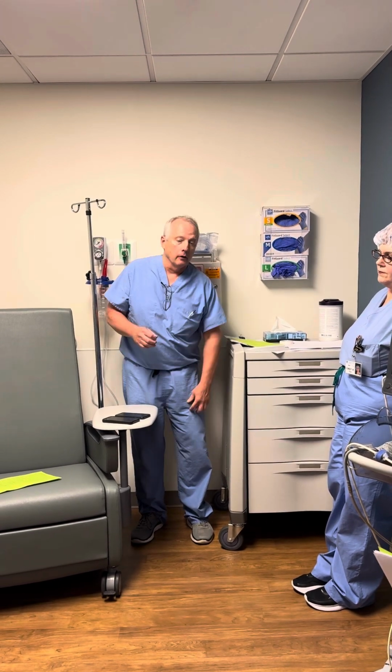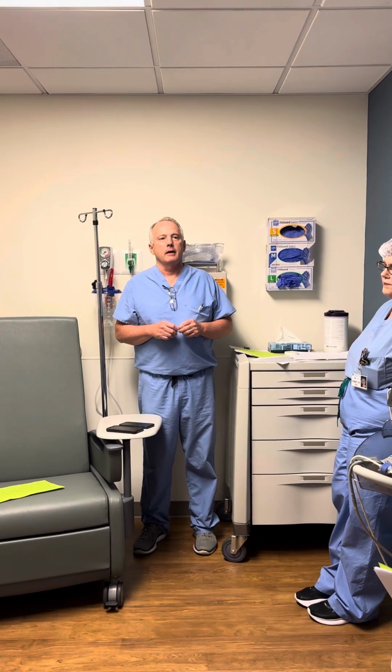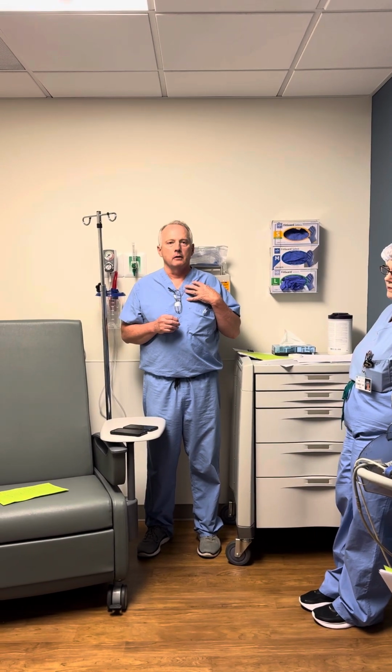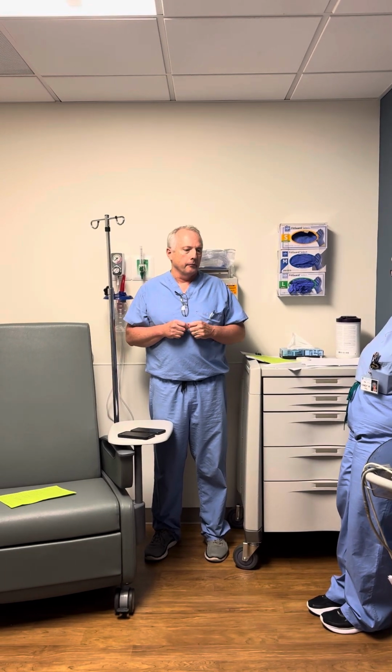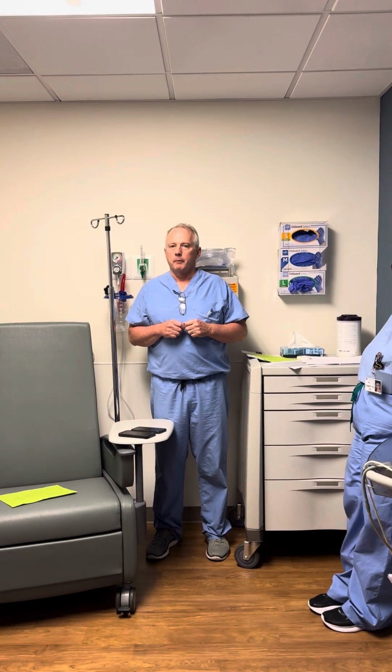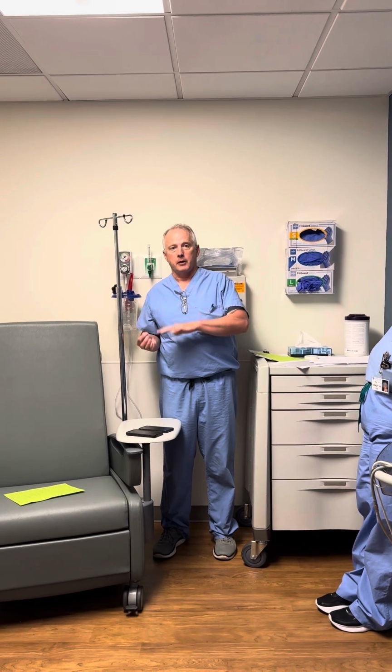For a defibrillator, the idea is to actually disable the therapies that could be delivered, such as a shock or anti-tachycardia pacing. It used to be that we would come in and program these devices off for the surgery, and then program them back on.